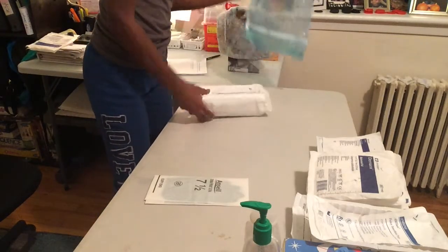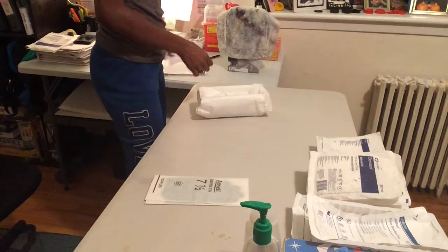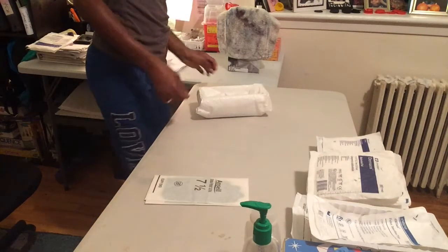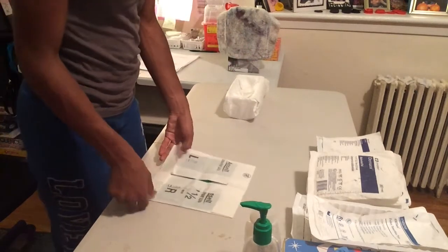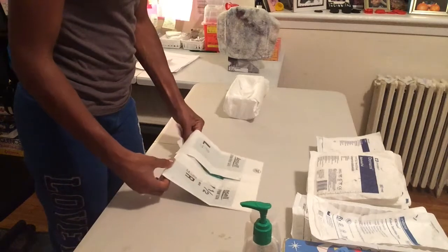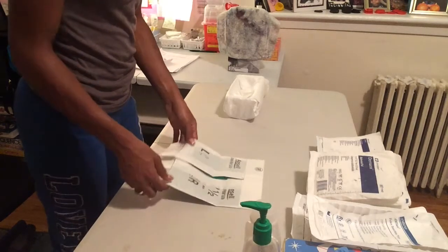Now I'm opening the actual catheter kit. I removed the outside packaging, threw that in the garbage, then I took out the paper on the inside that tells me the size of the catheter I'll be using. Now I'm opening the sterile gloves.